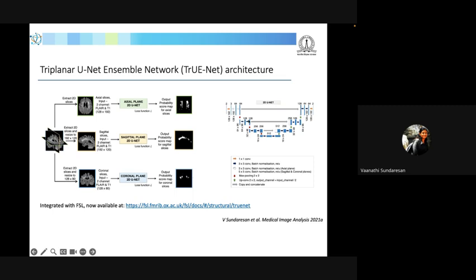The encoder extracts the texture-based features, and then it consecutively downsamples and pools the image. In the decoder part we have upsampling, where we lose all the very localized texture-based information, but what we have here is the location of the object. So the encoder has texture-based features and the decoder has location-based features.